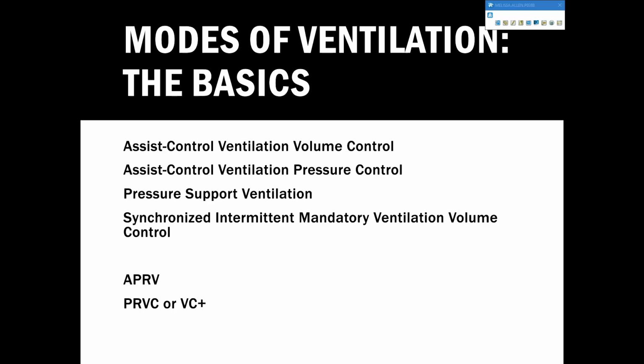And the reason it does that is the way the breath is delivered. It's more anatomically correct. Here, I want you to go through this with me and imagine what I'm talking about. On volume control, we have a descending flow ramp, and yeah, it kind of works, but it doesn't descend as much as it could.